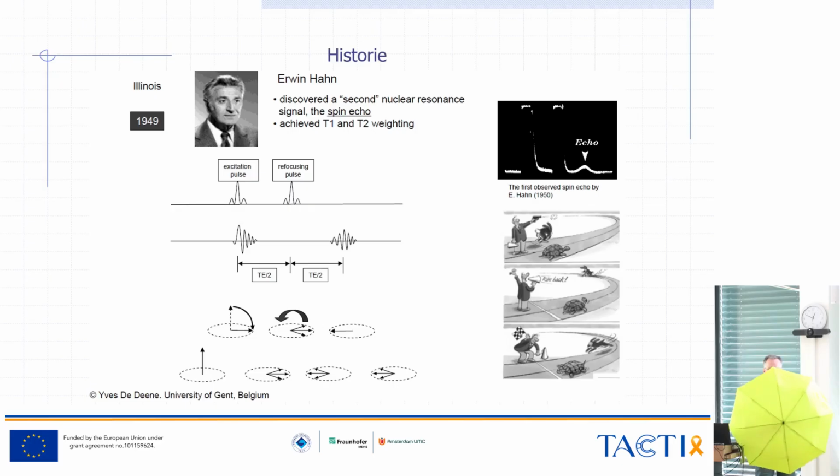It's in 2 dimensions, so the rephasing is more like this. I wanted to use one of those hand fans, but I wasn't able to get one, sorry. They will just fan out.